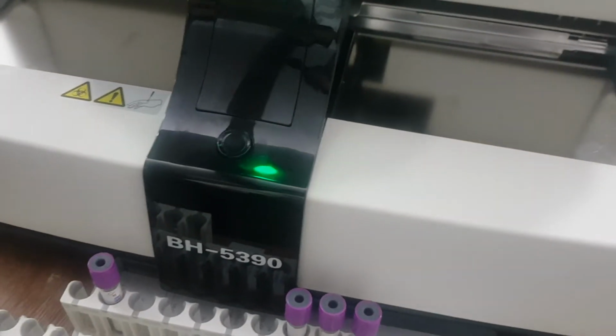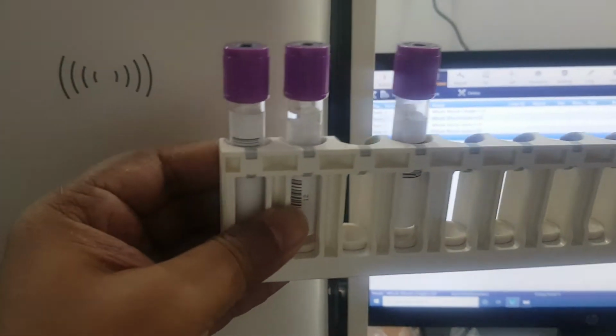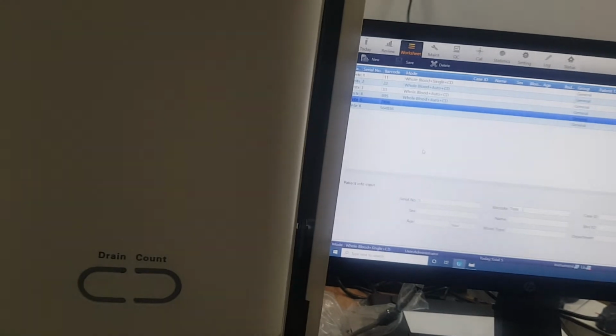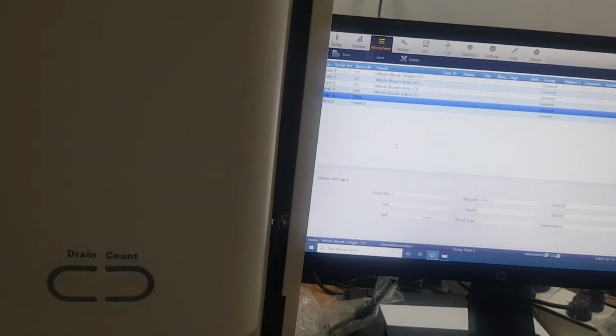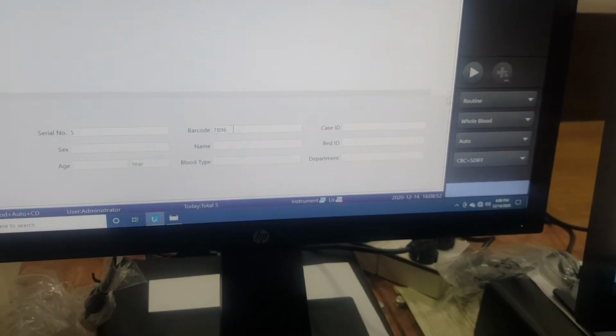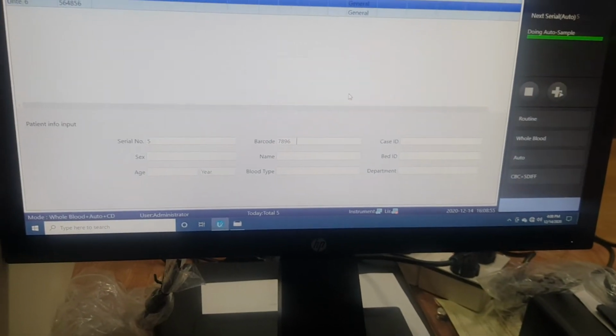And again, when we go for a rack, we go for a rack with the same configuration, 2 samples in position 1 and position 2, and position 3 is empty. We run in position 4 and let's see. Okay, whatever, we don't have one barcode here. Okay, this one. So we make here auto and we run.